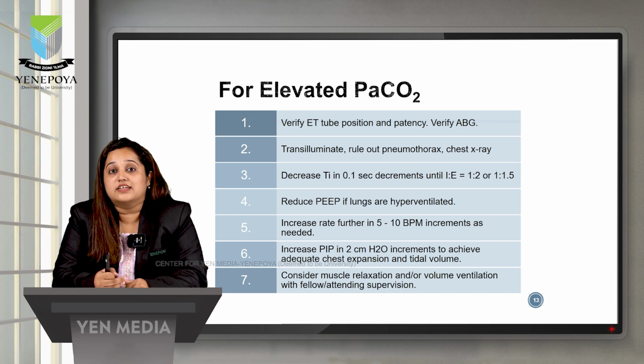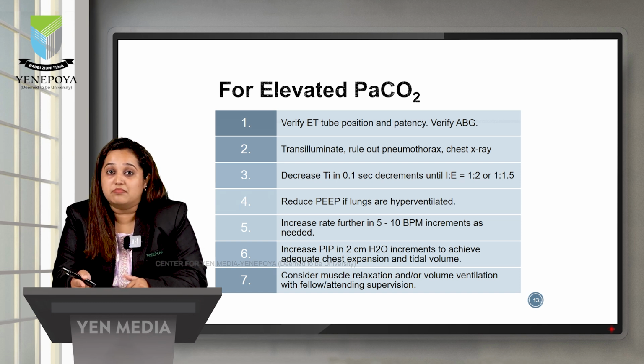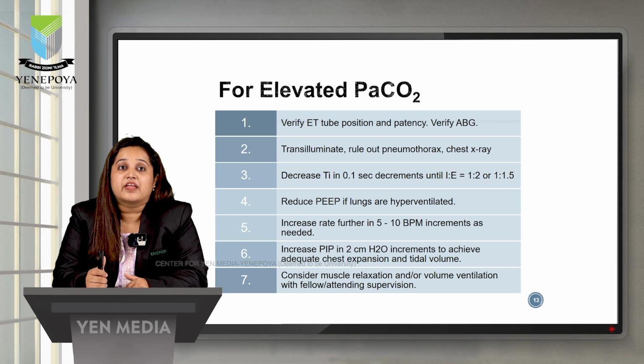So when I say increase the respiratory rate, it is not like the respiratory rate was 35, you suddenly made it 50. No, you can do the increments at 5 breaths per minute or at most by 10 breaths per minute increments. Okay.